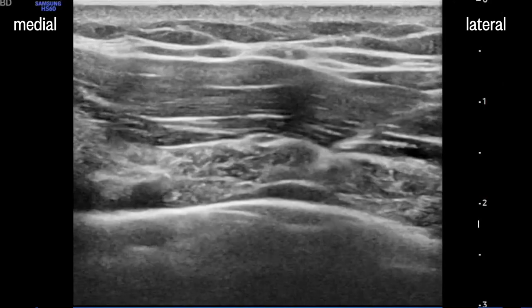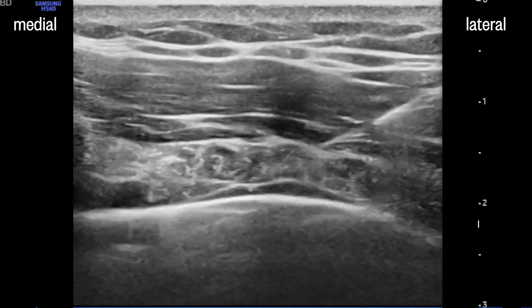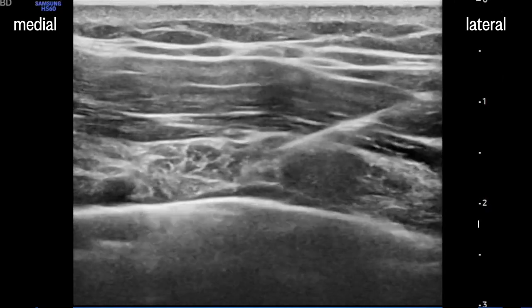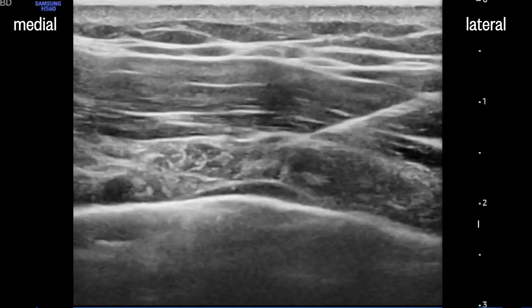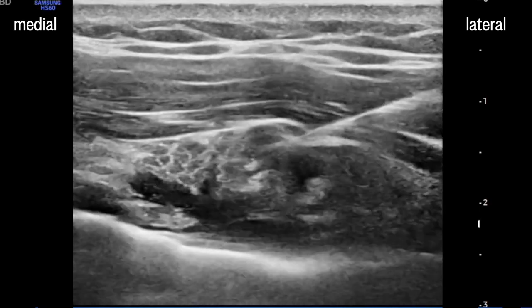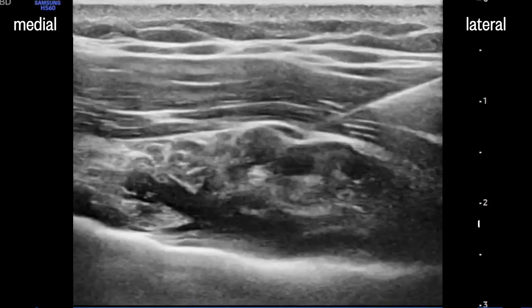A small injection to hydrolocate the needle tip shows that we're in the intercostal muscle itself. The needle is advanced another few millimeters and the test injections repeated until we see the injectate depressing the pleura and spreading medially. 20 mLs are then administered here.